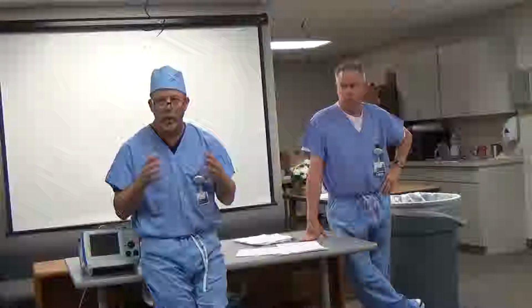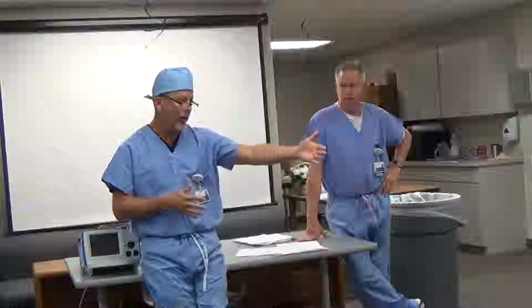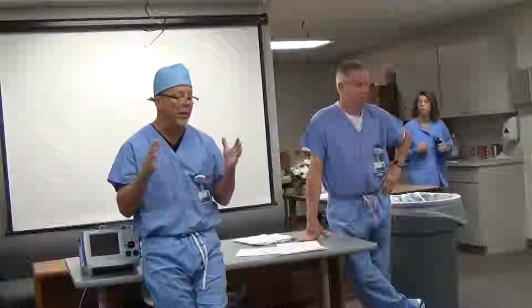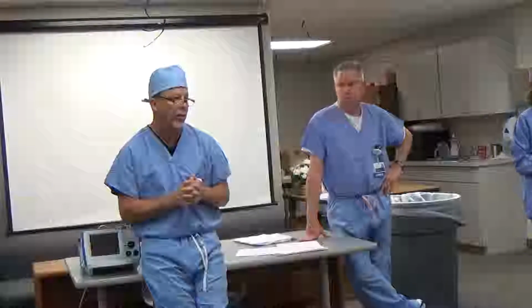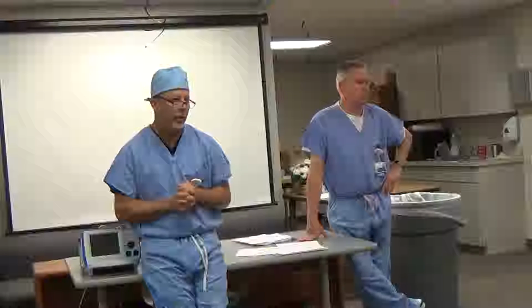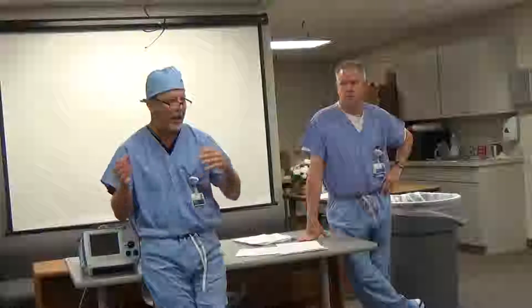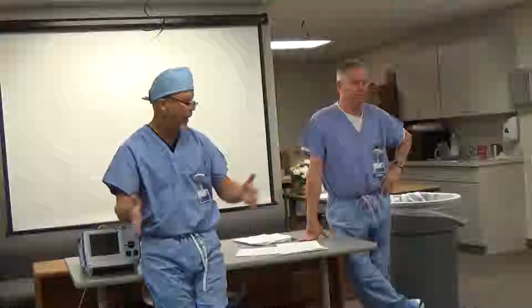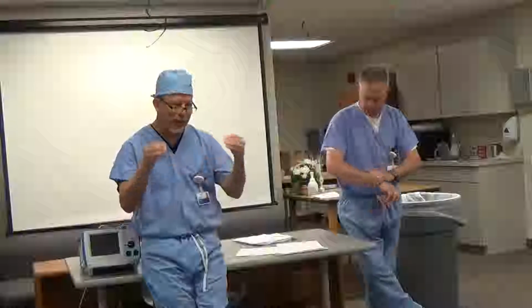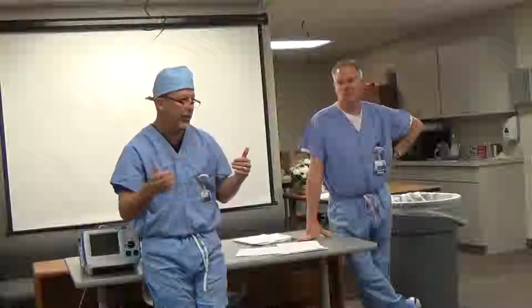So it'd be real important for those who are in the PACU or the CRNAs that are there to know the ambu bag's there, to grab it, establish positive pressure. And that's usually going to fix a pediatric situation. But where do I go to get the crash cart? RCC. That is a really important thing because a lot of times we'll drag the adult cart out of the hallway into the PACU for a kid. Yes, it is okay to do that, but it would be a better idea to get the one out of RCC to bring in there.